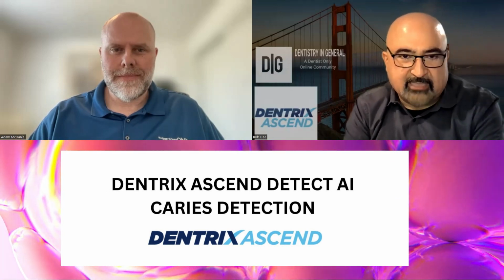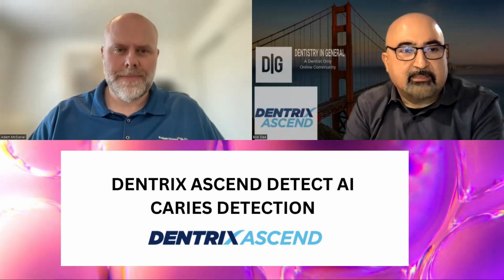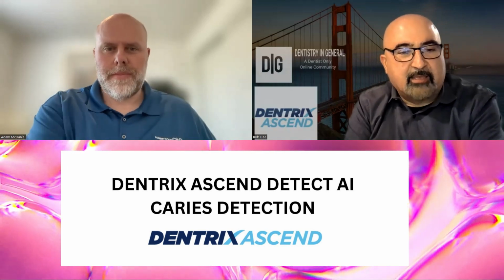We are talking about the AI that is integrated in Dentrix Ascend. Adam, can you take a couple of minutes introducing yourselves and what you do for Henry Schein, and tell us about what we're going to talk about today?